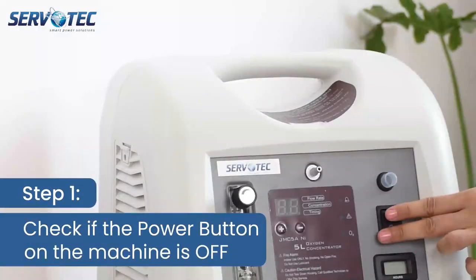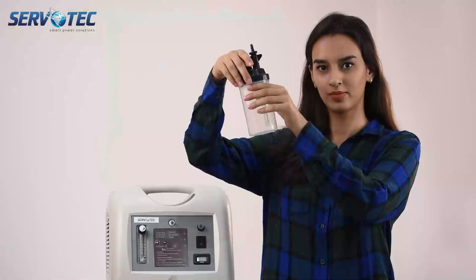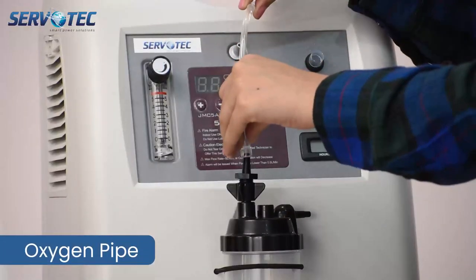Step 1: Check if the power button on the machine is off. This is the cannula pipe. This is the humidifier bottle. And this is the oxygen pipe.